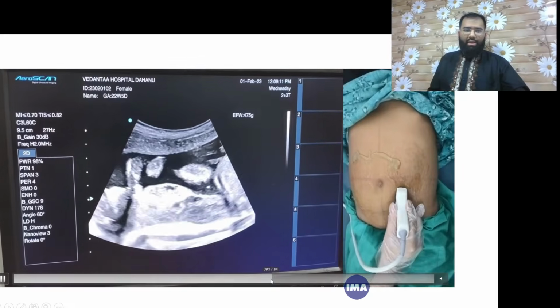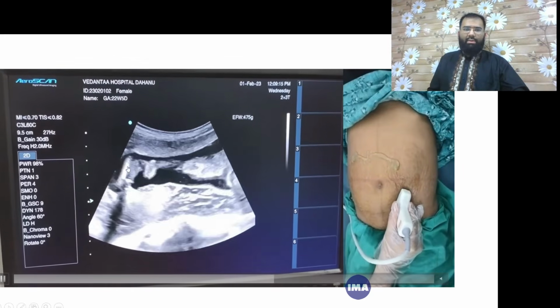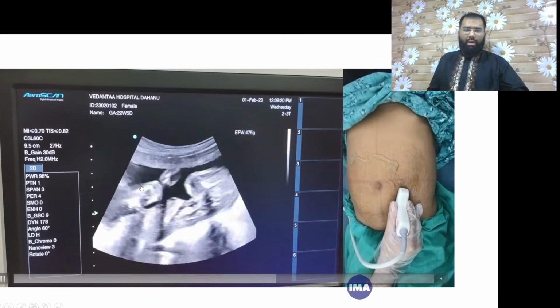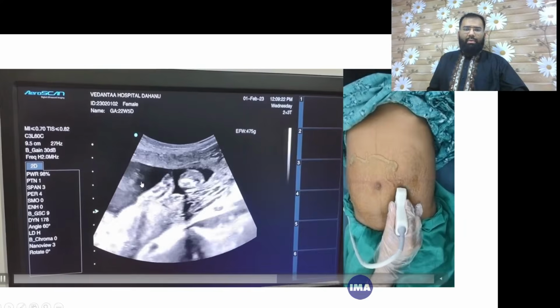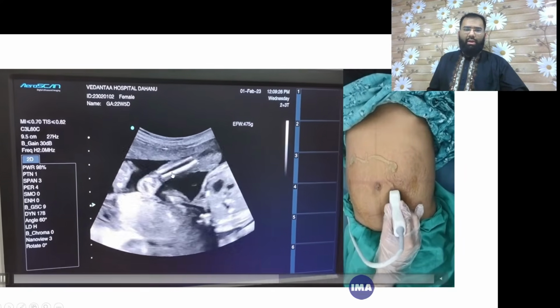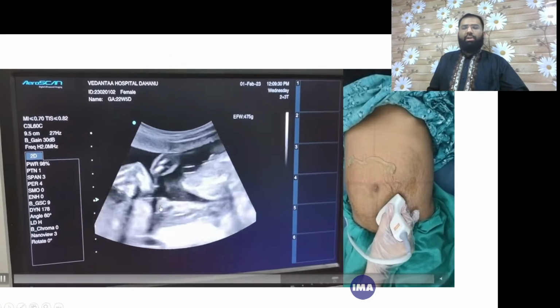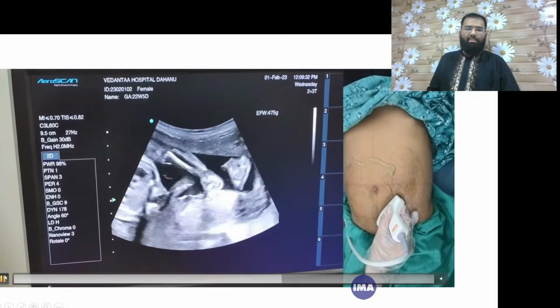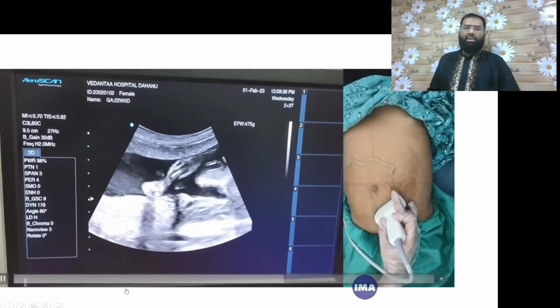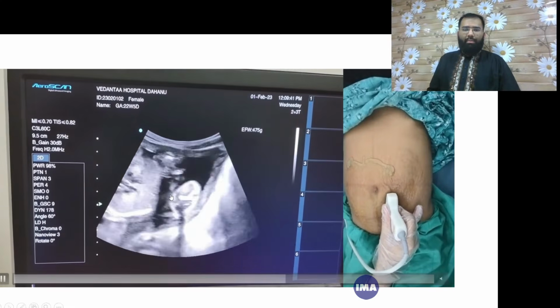I'll show you again. See how they look here. Yes, this was the extension. This was the movement which is performed by the fetus at its ankle joint. And again, you are able to clearly see the tibia and fibula. And most importantly, when you see tibia and fibula, you should not see the metatarsal bone in the same image, or else that signifies clubfoot.